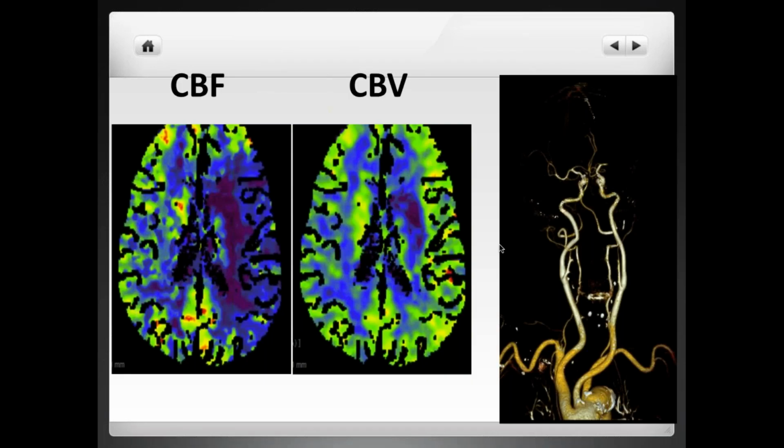So here we have perfusion, and here we have the cerebral blood volume showing you the core of the infarct right here. So a pretty small core, but look at the blood flow here. This is a very large area of penumbra. Almost the entire MCA territory is still not infarcted, but at risk. That means that this patient is at risk for developing a massive MCA stroke, which the patient does not have at the moment, and this is all thanks to the perfusion that is telling us.